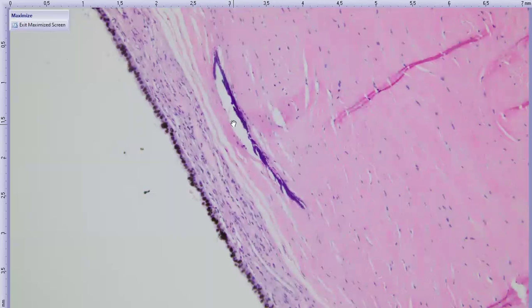And this is a really common finding in older horses, and it's a clinically incidental finding. So it's presumed age-related degenerative change. If you see it in your horse globes, don't worry. And that's the only reason why I'm showing it to you, just to say, here it is, don't worry.